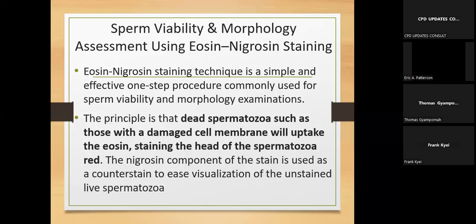If you stain the background of the sperm cells, what does it do? It gives you the opportunity to visualize the sperm and discern all the features of the sperm. Because if you have a sperm and the outside has been stained, then it brings out the sperm on the stained background so that you can see its shape.